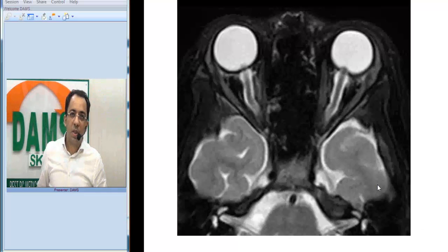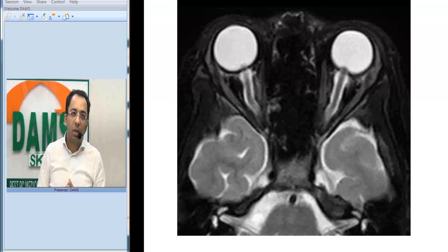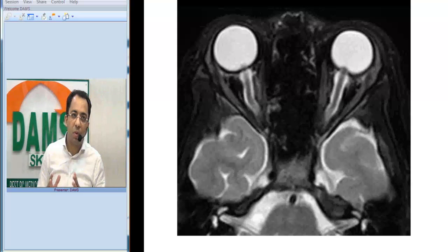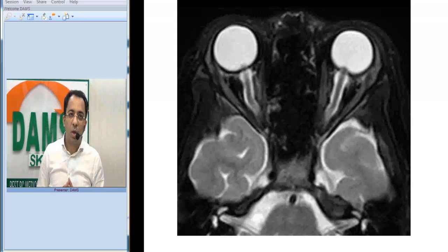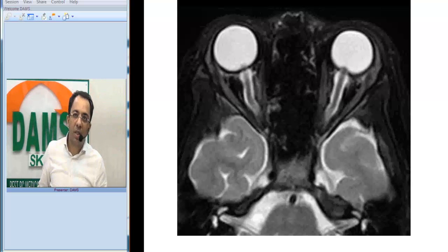This is a young female who presented with headache and blurring of vision. The MRI brain otherwise did not show a focal space-occupying lesion, and we did not see any evidence of venous sinus thrombosis. What do you think is the finding in this MRI image?